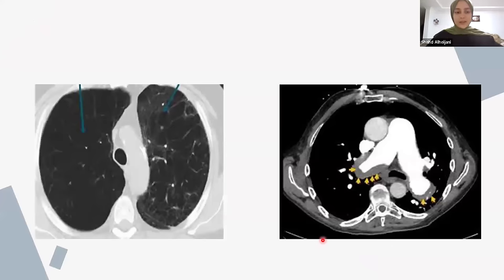Now, that being said, let's look at this image. What is the structure that you can see the clearest? So if there's any abnormality, you can see the most. Can you tell me in the chat? Exactly, the lungs. So which window is this? The lung window. Any abnormality in the lung, any fibrosis, any tumors will be clearest in the lungs. So this is the lung window, and the attenuation will be around -500.